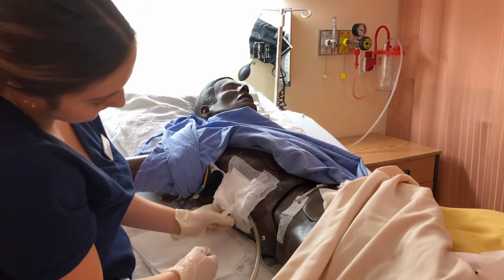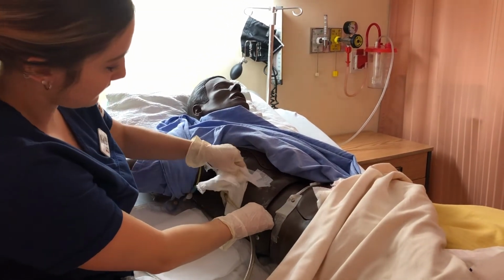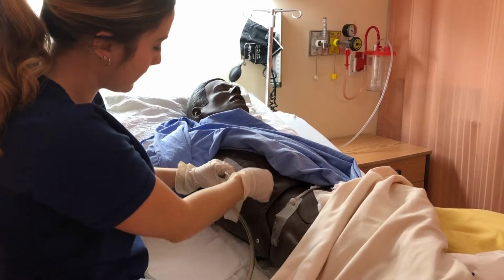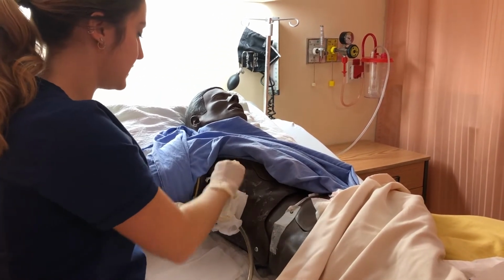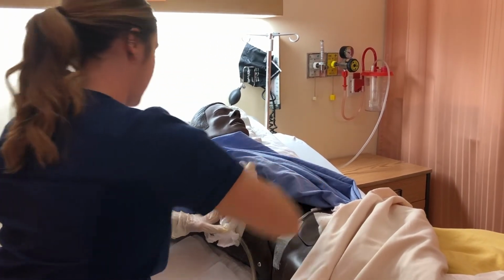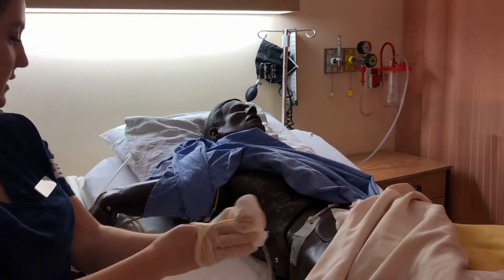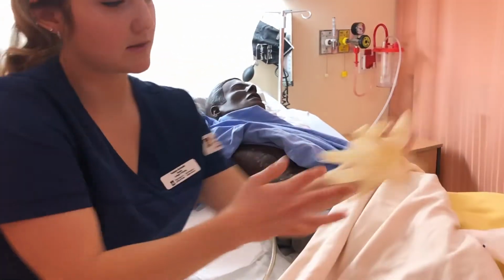And my bed is already at waist height, but if it wasn't, I would make sure that it was before I started. Being careful not to touch the site with my gloves. Alright. That's garbage, and these are garbage, just because they're super sticky.